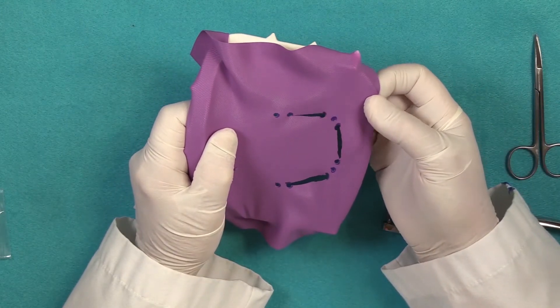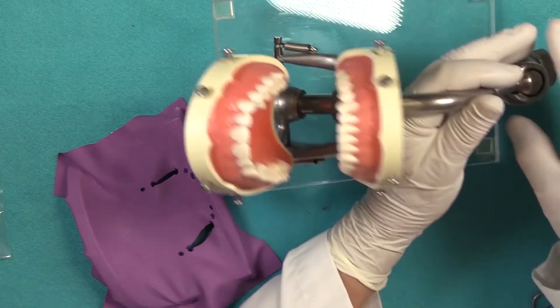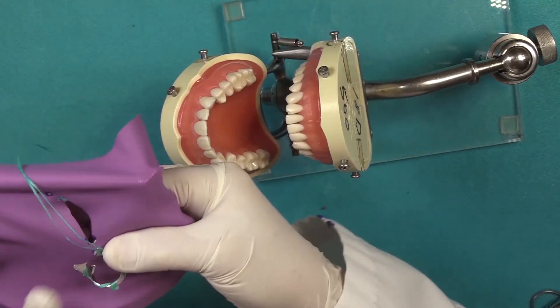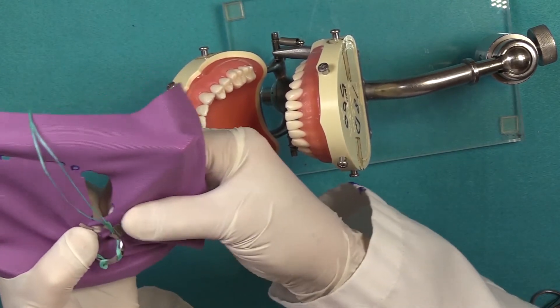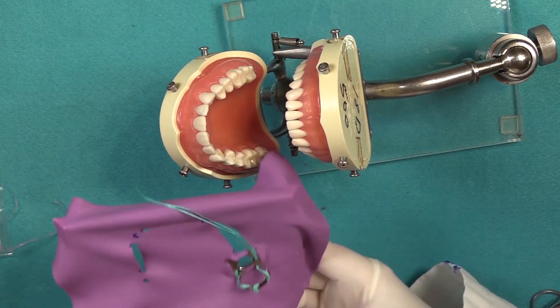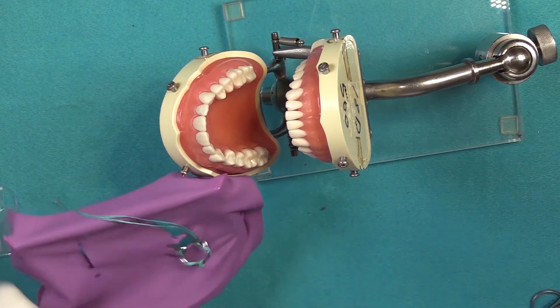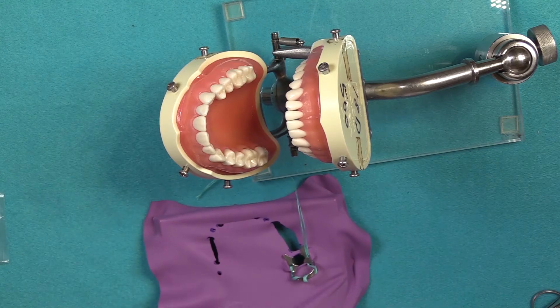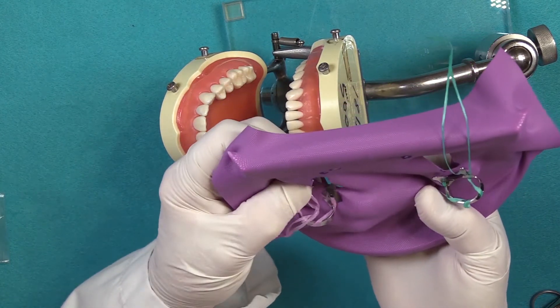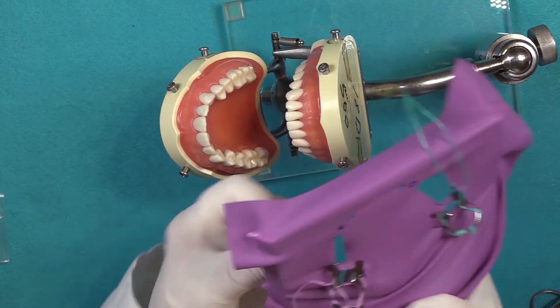You still have interproximal dam — there's your canine positioning. When you go to your patient, place the clamps into the dental dam first. It's always a good idea to put a safety floss on your clamp in case it becomes dislodged. Engage the floss through both holes — this way you can retrieve the entire clamp if it should break into two pieces, which can happen.